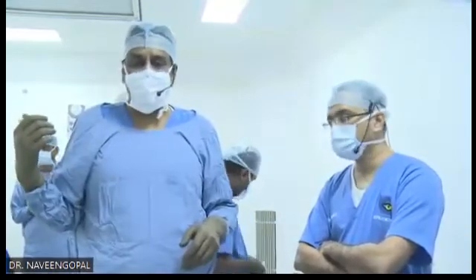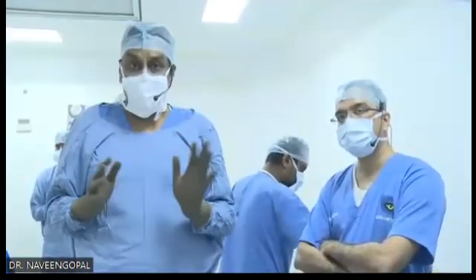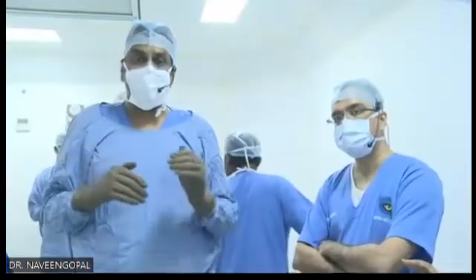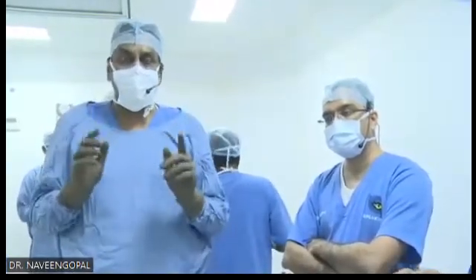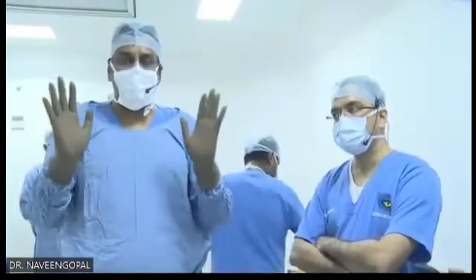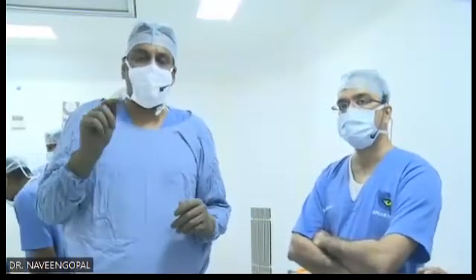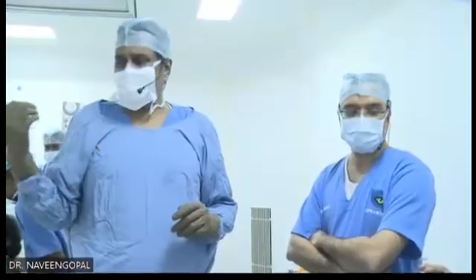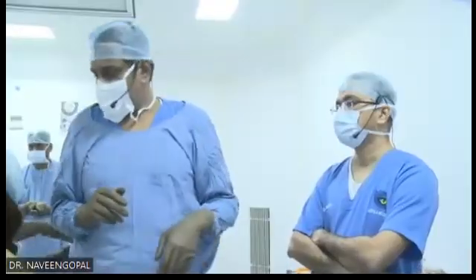She had a corneal astigmatism. Astigmatism in the sense, not what you get on your AR. What you get on your AR is the combination of cornea, lens, and retina. No, not that. You have to take your K1, K2, and the difference between that should not be more than 1. That is what I meant by astigmatism. If it is, this is 0.25. If it would have been 0.5 and above, I would have done an OCCI again on the steeper plane. That is how I manage multifocals.